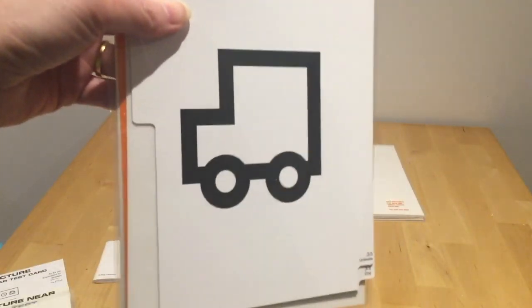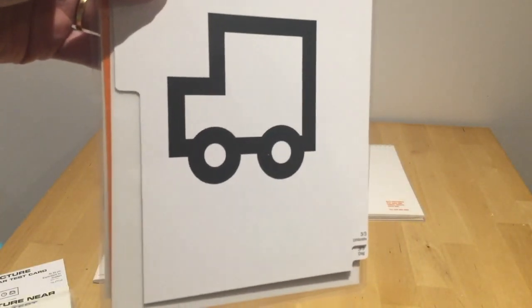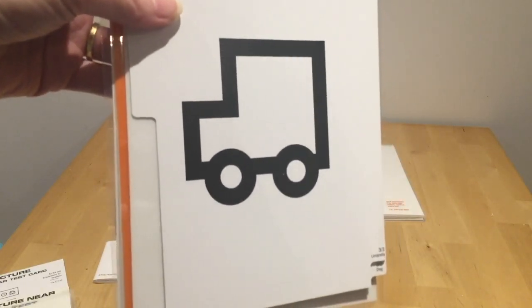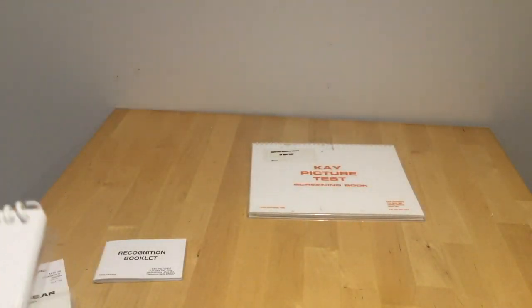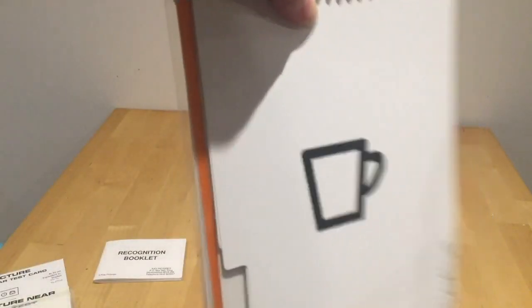So there we have our van. So it's limited in terms of what you can choose because of the symbols appearing on the key card. So if the child or young person is unable to name it, it's slightly restrictive. So the next one, we've got the boot, the cup, and the cat. So we could use the boot or the cup for this one. So let's choose cup, and here we are.